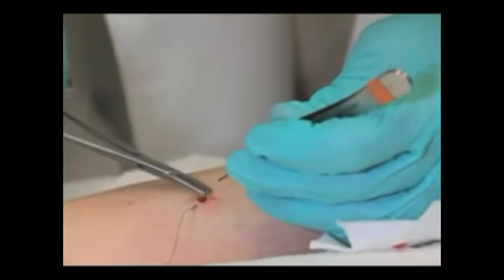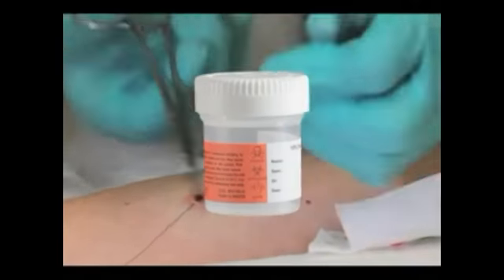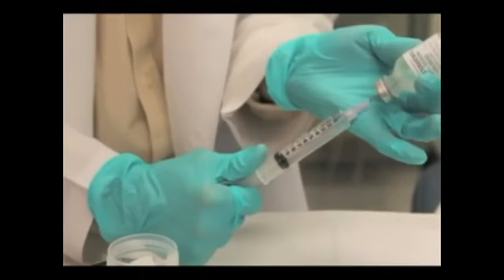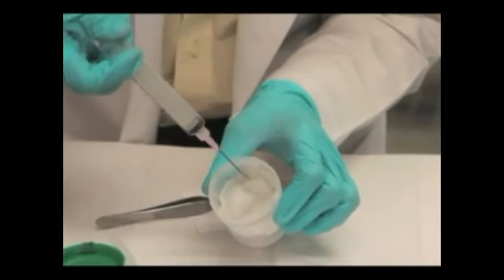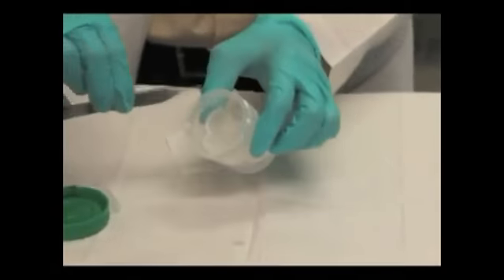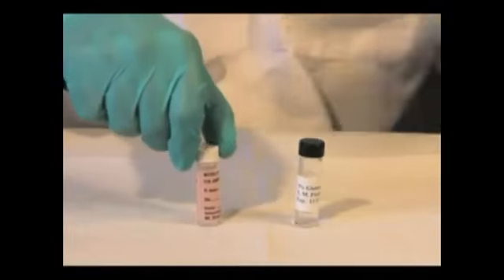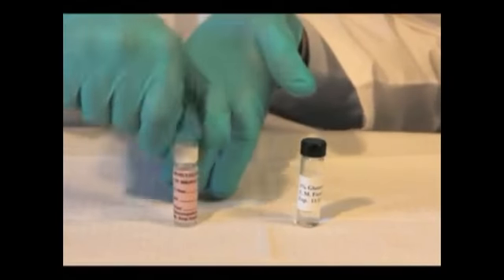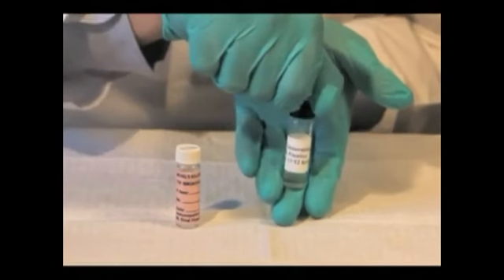The vast majority of skin biopsies are transported in formalin for routine hematoxylin and eosin staining. If a tissue culture is needed, sterile technique should be used. The specimen must be placed on a 2 by 2 inch piece of sterile gauze pre-moistened with 10 cc's of saline that is not bacteriostatic inside a sterile cup such as a urine sample container. For immunofluorescence studies, Michel's solution containing ammonium sulfate is used as transport medium. Glutaraldehyde is used as transport medium for electron microscopy studies.